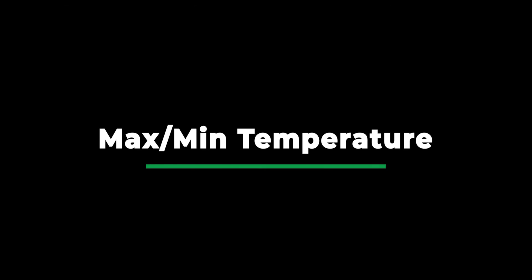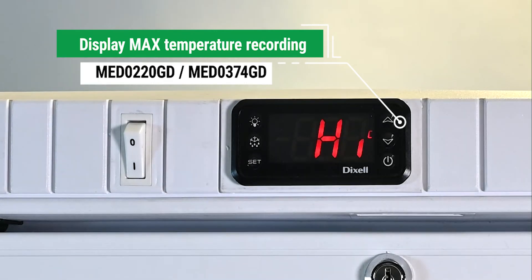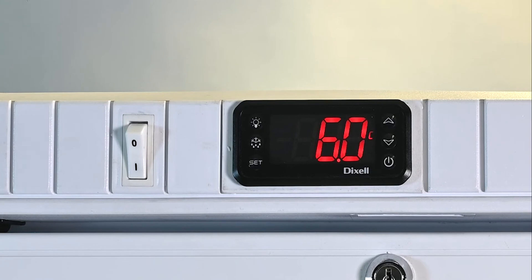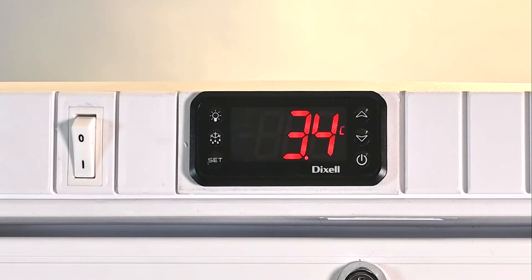Checking the maximum and minimum temperatures on the Med0220GD and the Med0374GD. To display the maximum temperature, press the up-arrow button. 'High' will be displayed on the screen, followed by the maximum temperature recorded. It will be displayed for 5 seconds or until the up-arrow button is pressed again, when the controller will return to the normal display. To display the minimum temperature, press the down-arrow button. 'Low' will be displayed on the screen, followed by the minimum temperature recorded. It will be displayed for 5 seconds or until the down-arrow button is pressed, then it will return to the normal display.